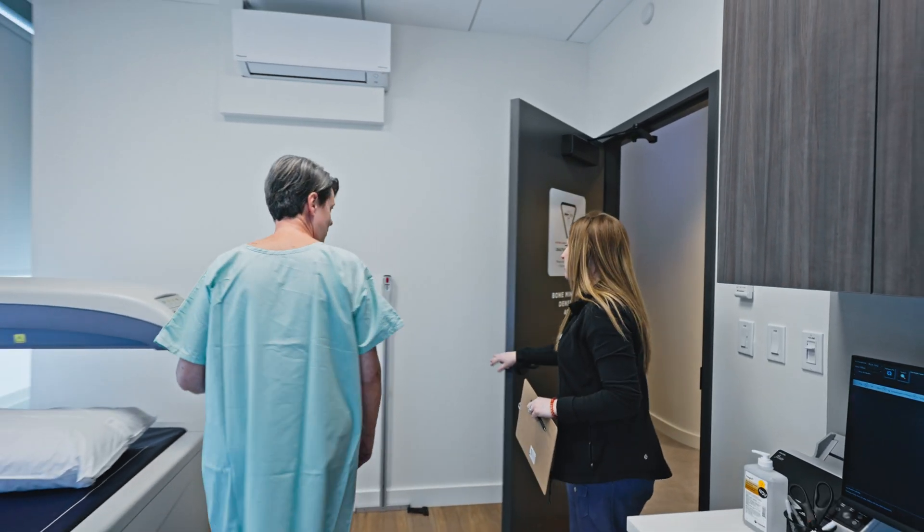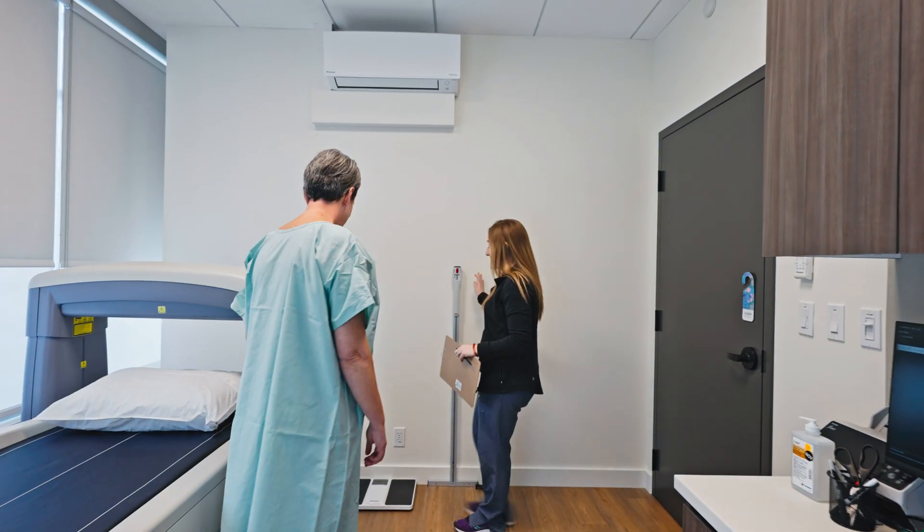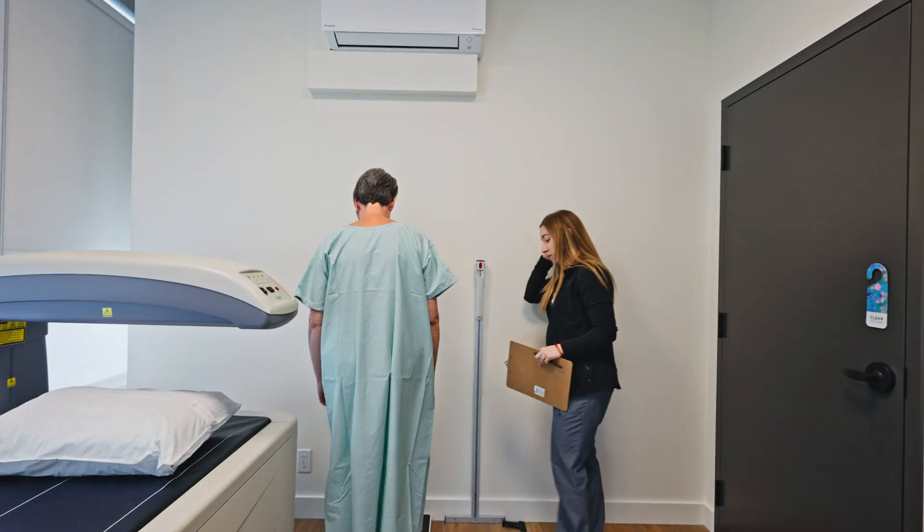So my name's Danielle. I'll be taking your bone density exam today, okay? We're going to start with a height and weight measurement, so I'll get you up on the scale here. Just when it says zero.